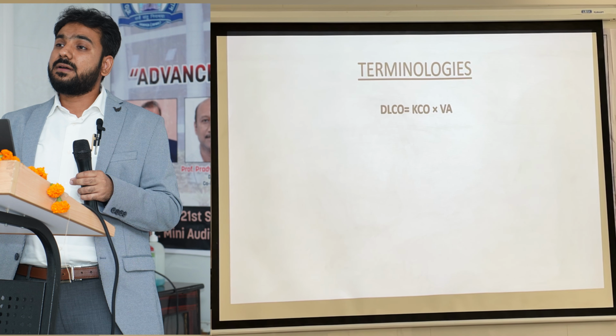Now terminologies, we will talk in a bit detail about these two terms. So as I already told, what we measure in DLCO is VA and KCO, and they ultimately tell us DLCO. We're not directly talking about DLCO. So let's just understand what is VA. VA is obviously alveolar volume, and that is the alveolar volume which is accessible. That means it is actually taking part, it is reaching the alveoli and it is taking part in the diffusion.